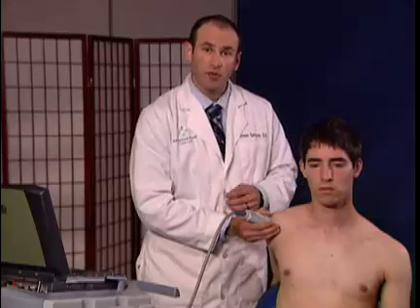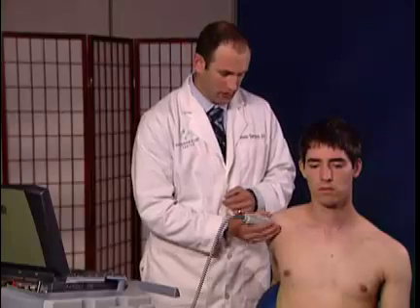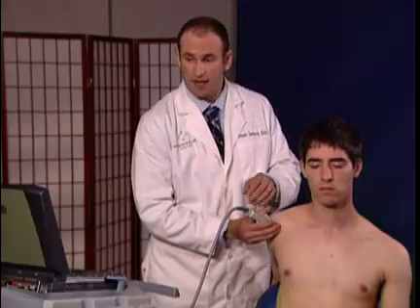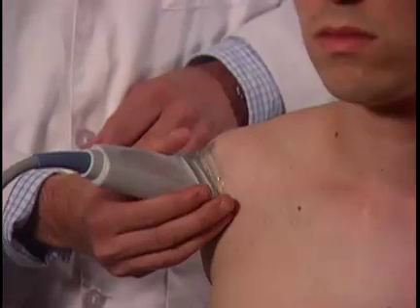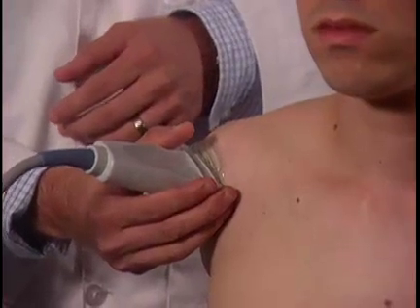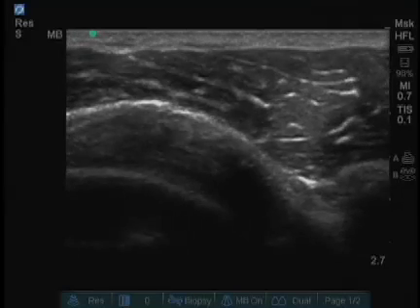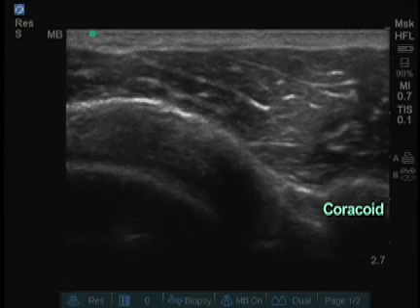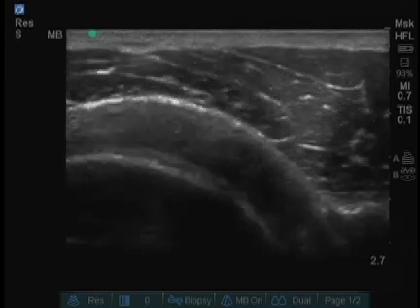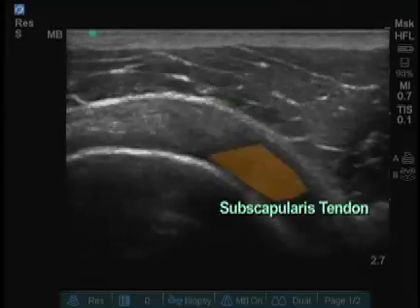Next I prefer to look at what's called the rotator cuff interval. To do this I maintain the same position that I'm currently in and I'm going to slowly move the probe medially towards the patient. This will allow me to visualize the bicep tendon as well as the subscapularis tendon.